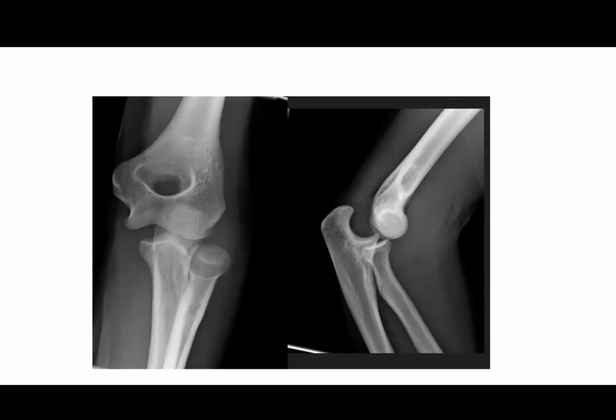Well done. First of all, when you describe an X-ray, you said it's posterior. If you look at the AP, there is a lateral element of dislocation, so this is posterolateral. Well done in identifying this is a posterior. Second, you have to comment on whether there are any fractures or not. This is part of the description of the X-ray. So you can mention, I cannot appreciate fractures, but if you're suspecting a fracture, I would like to reduce it and request a CT post-reduction. Third, don't comment on the ATLS, wait for them to ask the question. So they ask you one question, answer it. Done? That's great, thank you.